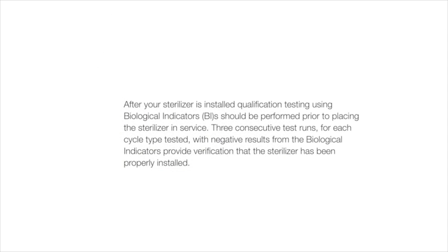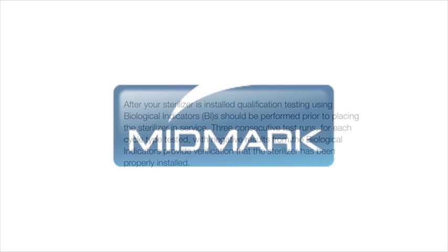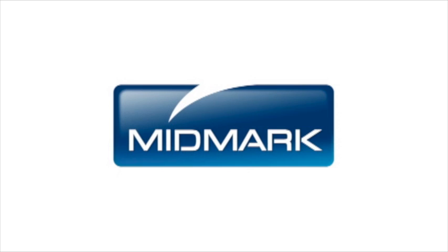After your sterilizer is installed, qualification testing using biological indicators should be performed prior to placing the sterilizer in service. Three consecutive test runs for each cycle type tested with negative results from the biological indicators provide verification that the sterilizer has been properly installed. For more detailed information, please refer to the M9-M11 installation and operation manual. For further support, contact Midmark Support Services at 1-800-MIDMARK.